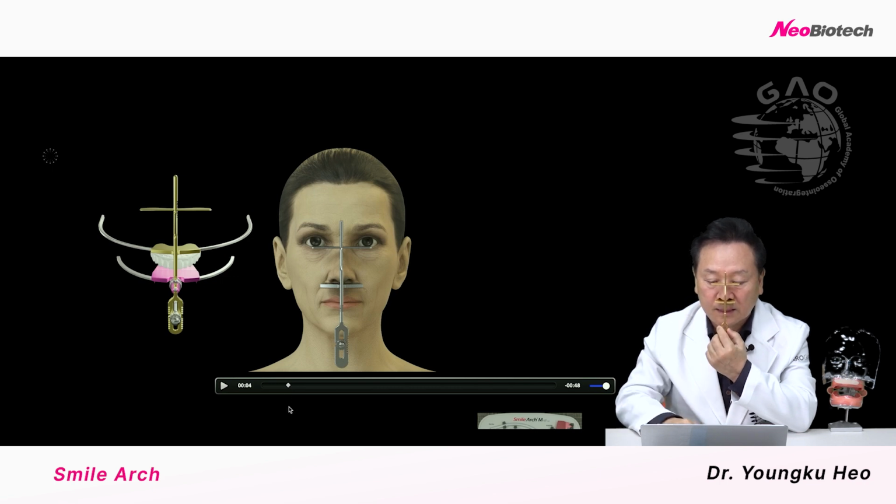We position this P point at the patient's subnasal point. There is a seat there. Don't push too much up, and don't position too much low, but just in the middle, a very natural position here. We're using this point as a reference point. If we put it here, there's a point here, you see here. So there is the interpupillary line. This is a standard.